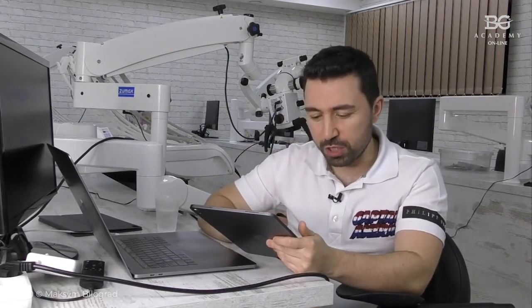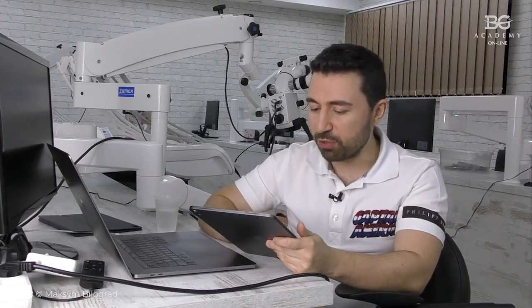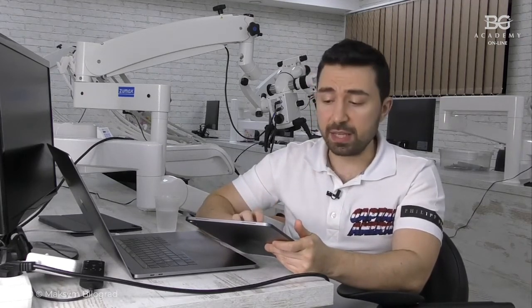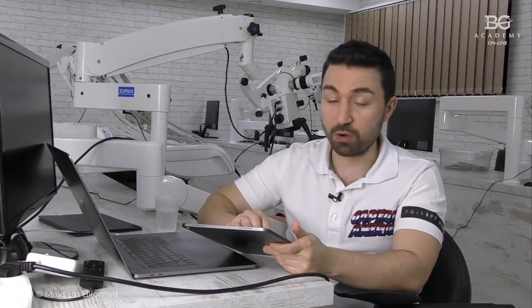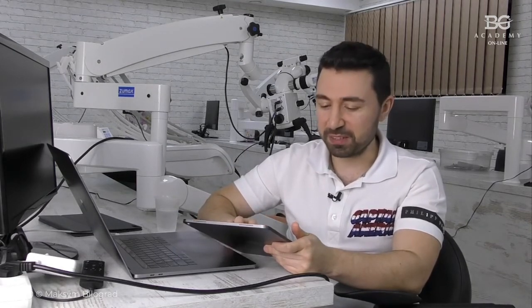The first question is from Prodent. What is the name of the black box that you keep the veneers in? The manufacturer name is Smile Line, and the name of this box is Veneer Me. The author of this box is Galip Gurel. It is a very interesting and very ergonomic device for preparing veneer surfaces, crown surfaces and overlay surfaces for bonding. I do recommend it.